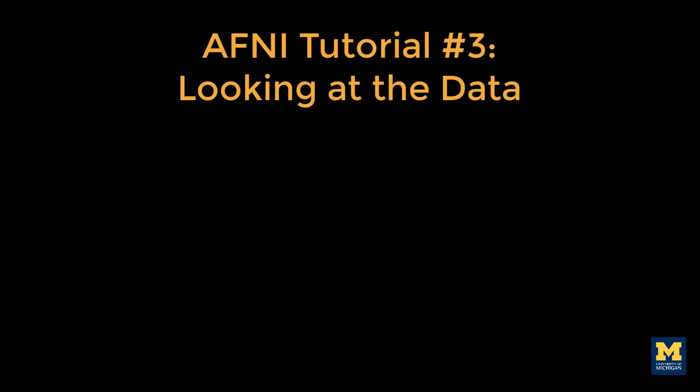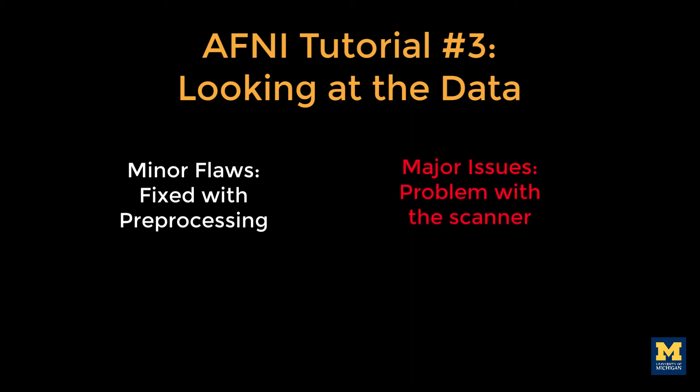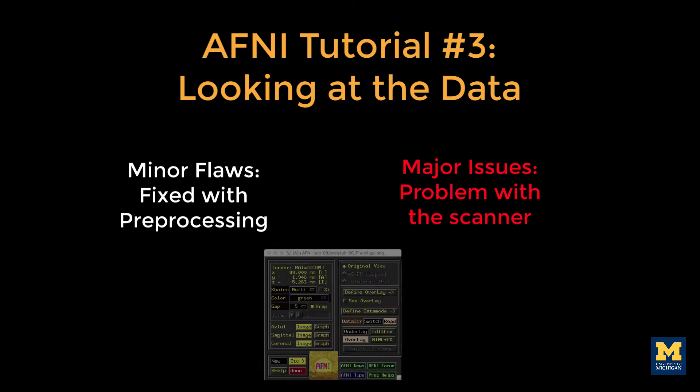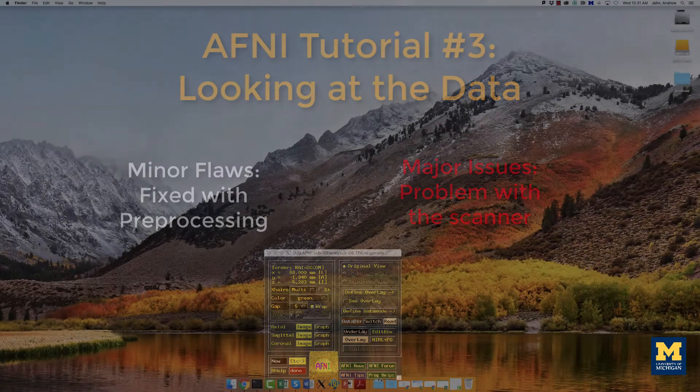Now that you've downloaded the data set and learned about the Flanker task, you'll want to look at your data to inspect it for any problems. As you gain more experience looking at these images, you'll be able to judge whether they are minor flaws that can be fixed by preprocessing the data, which we will discuss later, or whether they are major issues that indicate a problem with the scanner. In either case, you will need to look at the data carefully by using the AFNI image viewer.